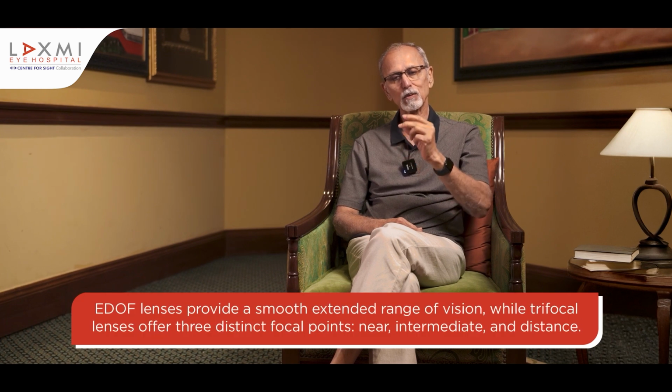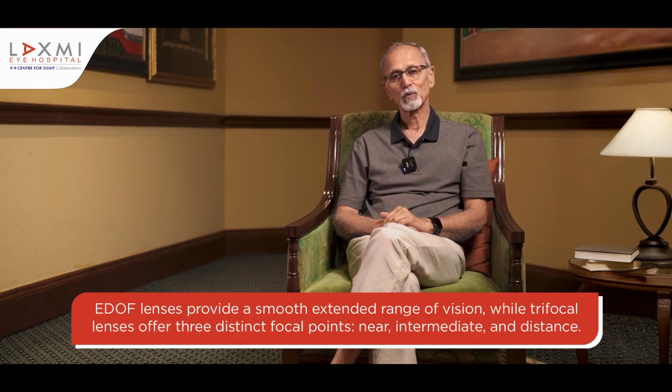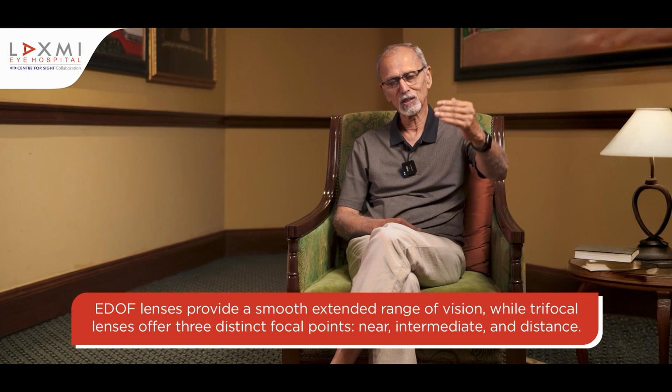So you'll ask me, what is the difference between an EDOF lens and a trifocal lens? A trifocal lens gives you distinct foci at different places, whereas an EDOF lens gives you a focus from intermediate distance onwards till infinity seamlessly.